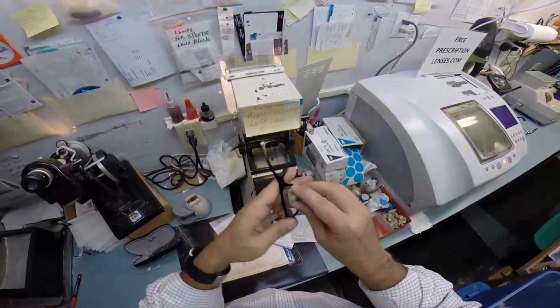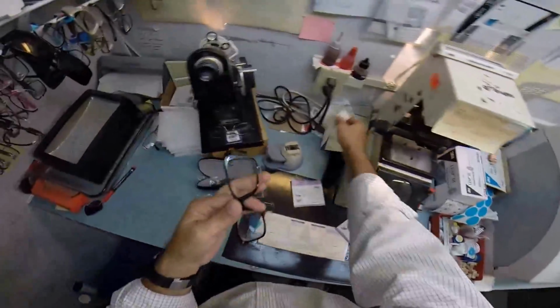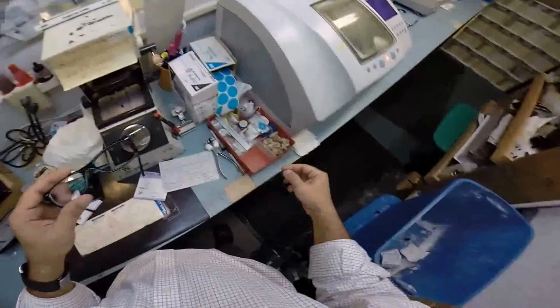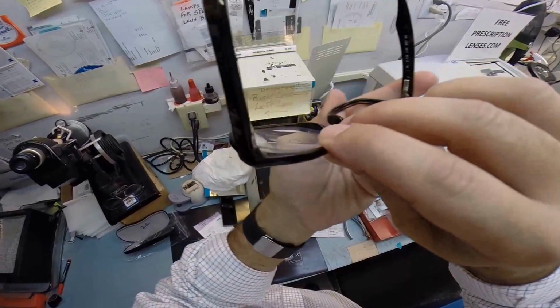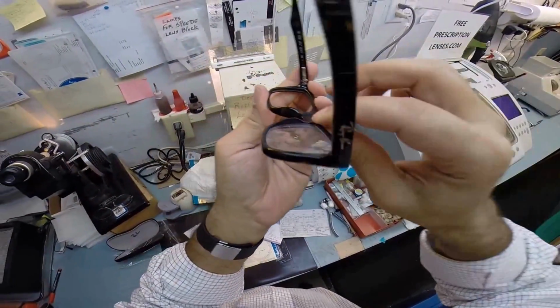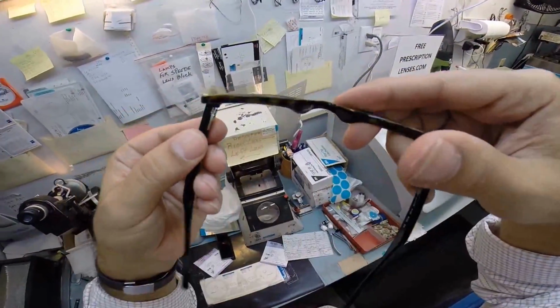Now, this block is no longer needed. If I was strong enough, can I do it? Can I do it? Yes. Pull it right off. I can only do that with lenses with an anti-glare coating. Now I'm going to pull that sticker off, and again we were concerned about edge thickness, but I just want to show you have none sticking out the side of this frame, so there's never any need to even think about polishing your lenses. So you have a great cosmetic finished appearance right there.